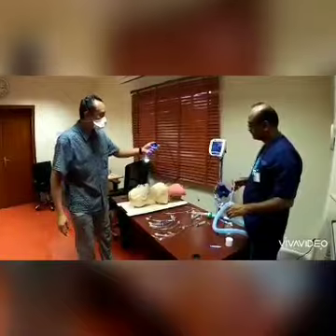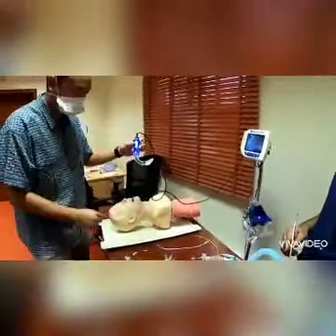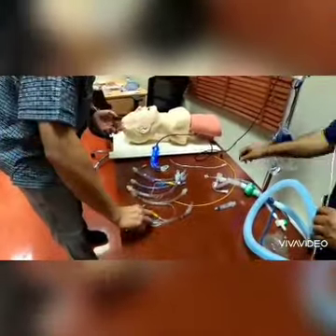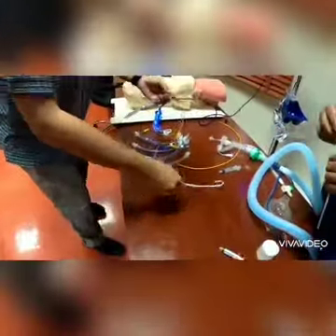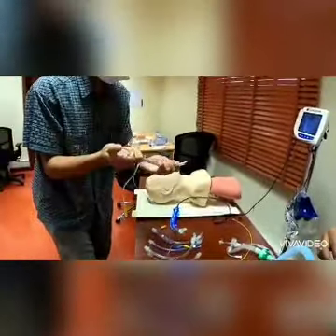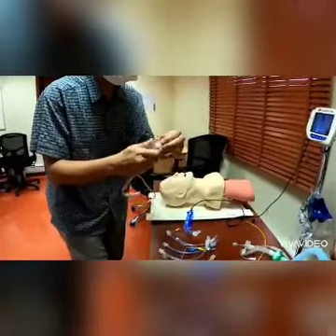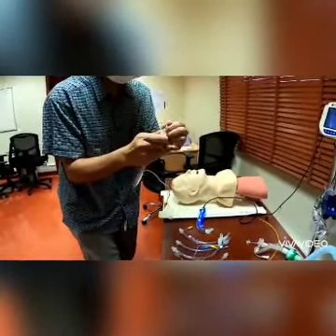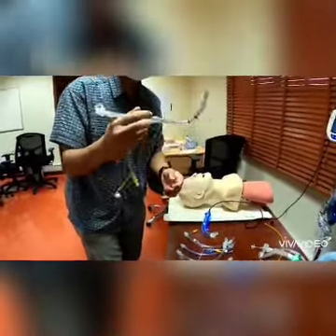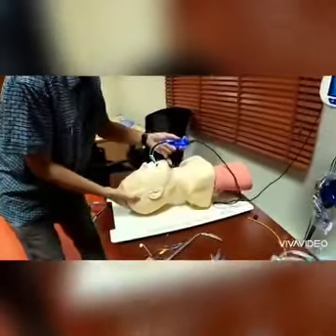Okay, so if you are intubating using a glidoscope, as you can see, the shape is much more curved and much more angled than the CMAC. So the only way to intubate this with a higher success rate is using a stylet. So you have to do this yourself. You insert a stylet, and once the stylet is in, you need to create an L shape. Make sure that the stylet doesn't go out too much in the end. Okay, you need to make an L shape. Once you have that, you use the same technique as the CMAC.